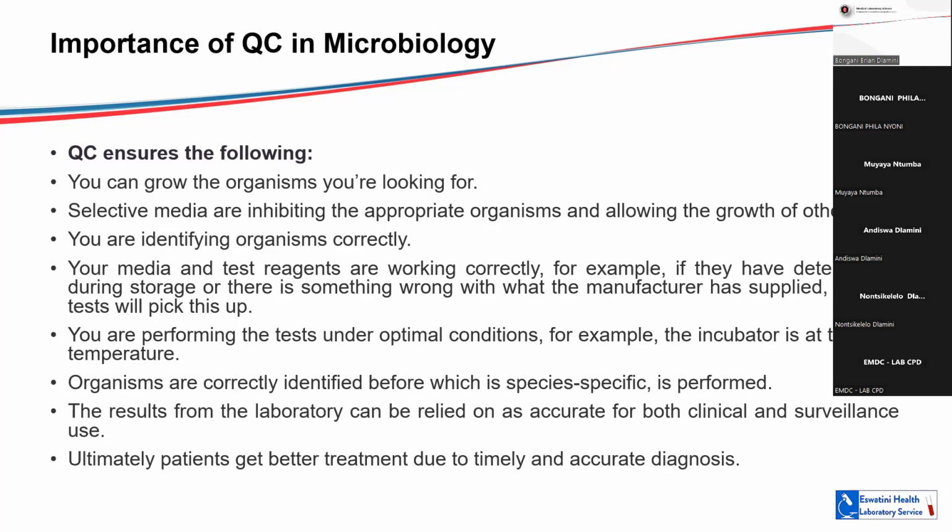And also it will ensure that organisms are correctly identified to species specific level before you can actually do your AST. And also ensures that the results from the laboratory can be relied on as accurate for both clinical and surveillance use. And also your patients will then get the correct treatment due to timely and accurate diagnosis.